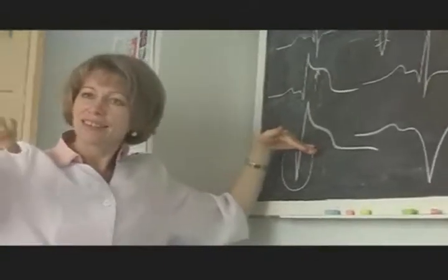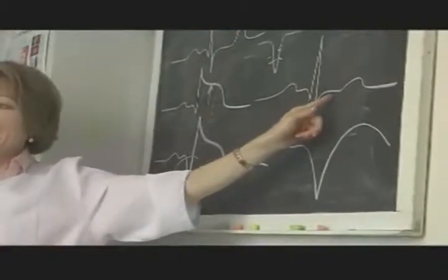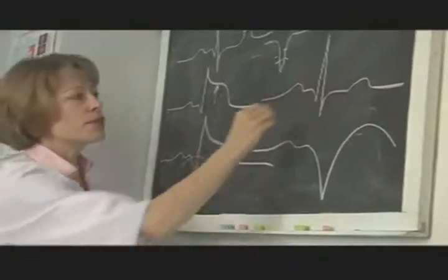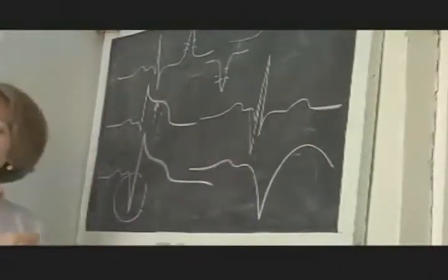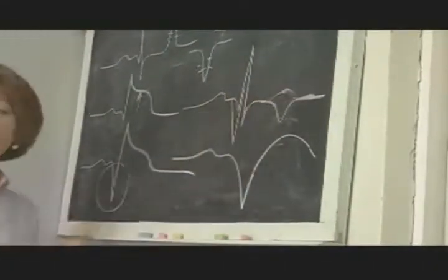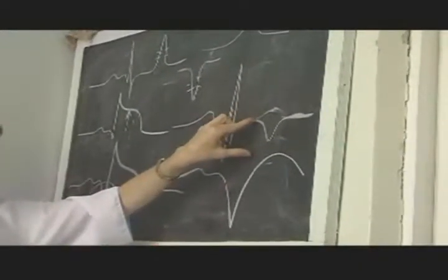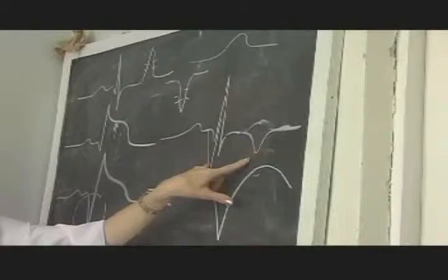It's regressed. On ECG, the ST segment moves to the isoelectric line, but there will be a deep Q wave. And there cannot be a normal T wave, there will be a pathological T wave. It indicates only that the pathological process stopped, but not completely healthy.